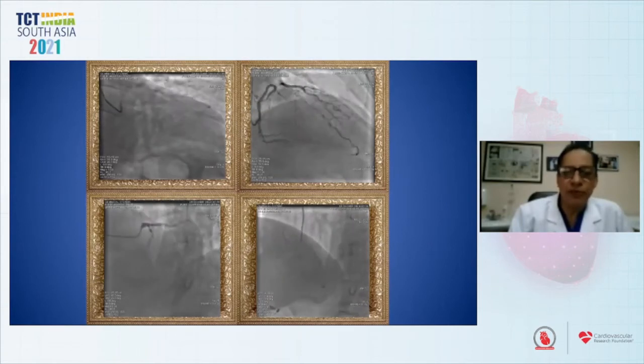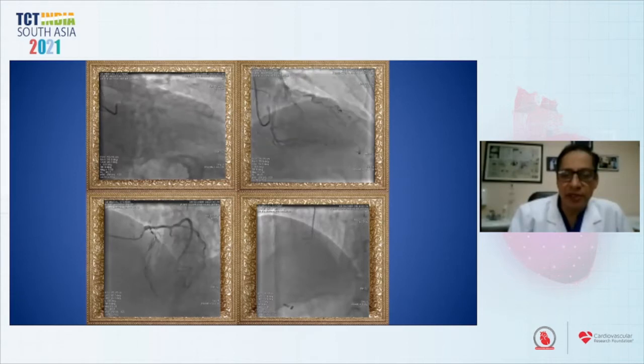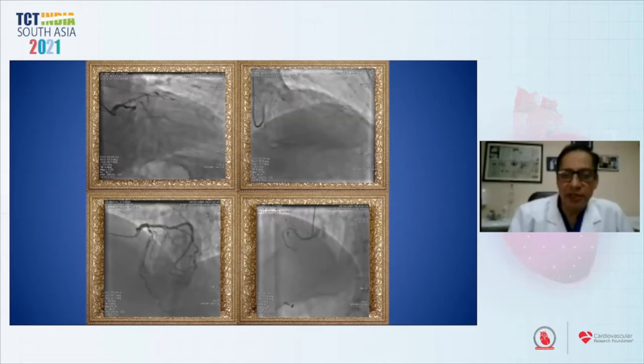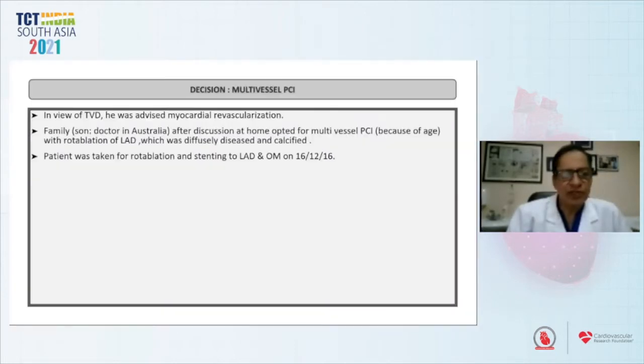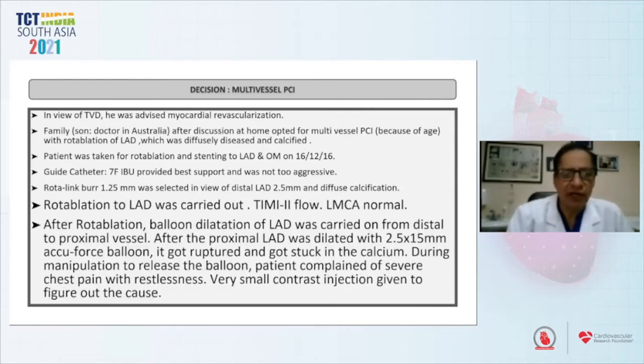The lesion was calcified. So we will be doing a rotablation with stenting, and then we will fix the OM also after doing the LAD rotablation. So once that decision was taken, 4 days later, the patient was taken up for rotablation.